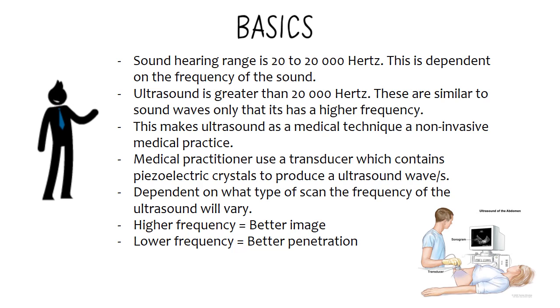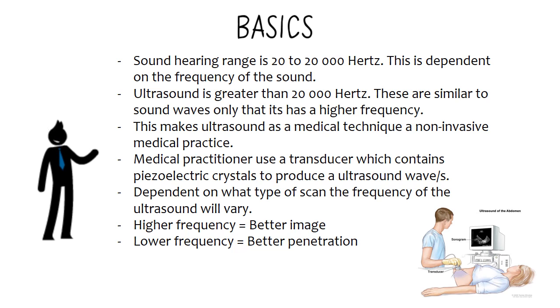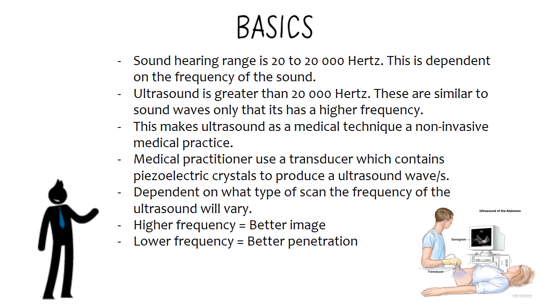Medical practitioners use a transducer which contains piezoelectric crystals to produce an ultrasound wave. This is dependent on what type of scan. The frequency of the ultrasound will vary. Higher frequencies will give us a better image, while lower frequencies will give us a better penetration.